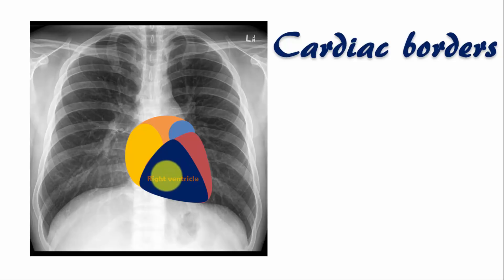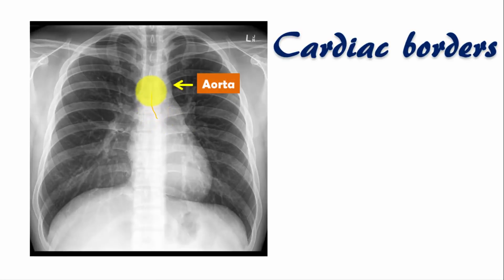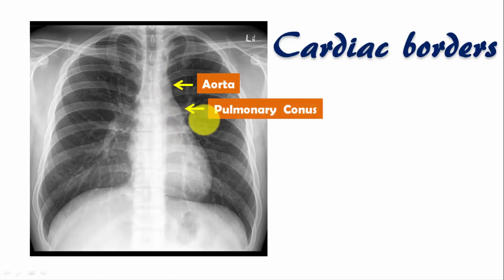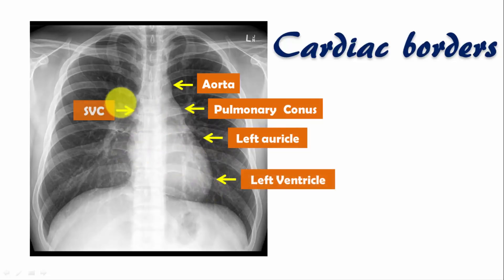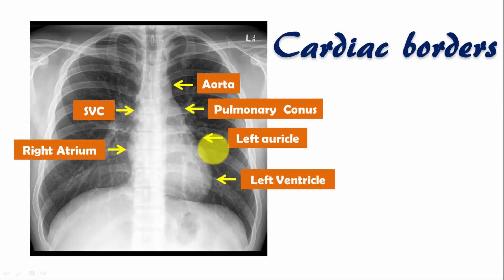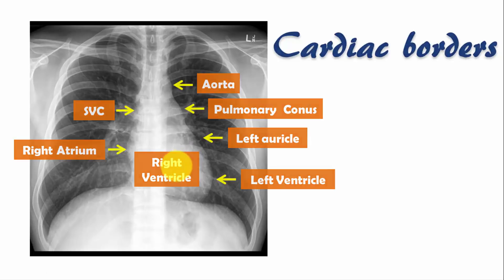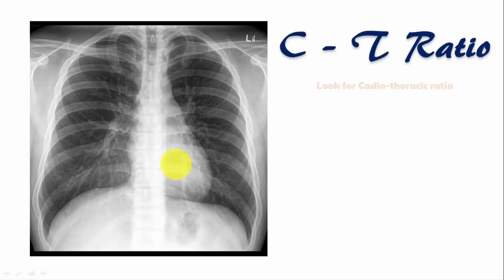The right ventricle forms the anterior part of the heart in the chest X-ray. Looking at the borders: here is the aortic knuckle, the ascending, transverse, and descending parts of the aorta, the pulmonary conus, the left auricle, the left ventricle, the superior vena cava, and the right atrium. The entire right border of the heart is formed by the right atrium, and the left border by the left auricle and left ventricle. The anterior part of the heart shadow consists of the right ventricle.